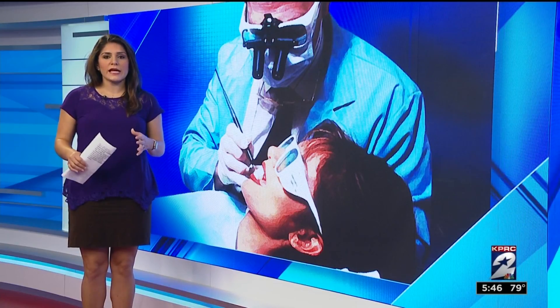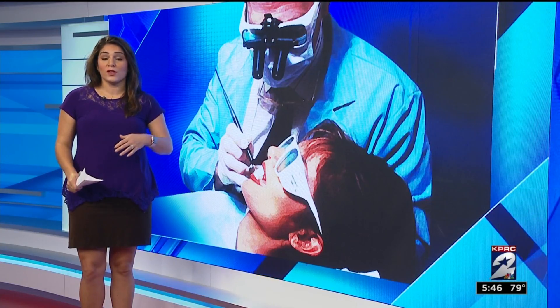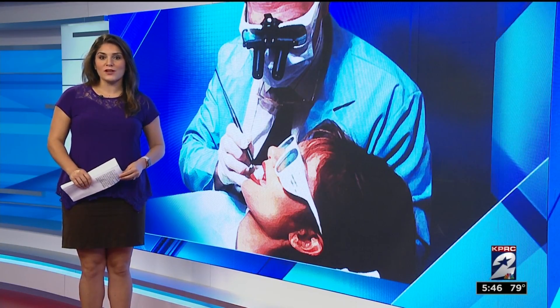Good morning, guys. So dentists take thousands of impressions of teeth every year. Many use what's known as the goop, but now it's out with the old and in with a new way to get a good impression of the teeth.